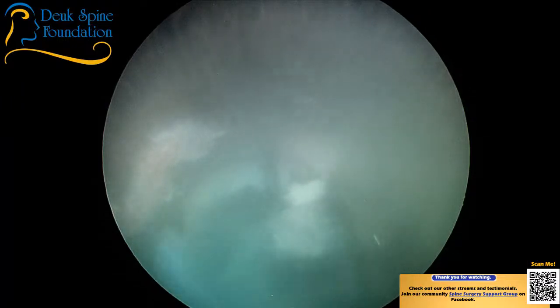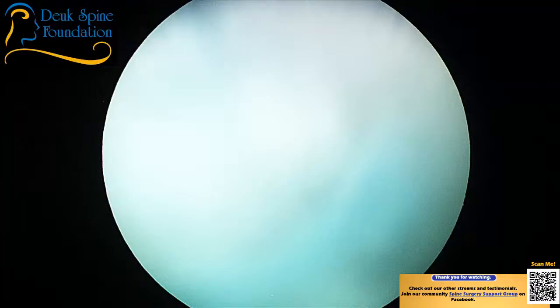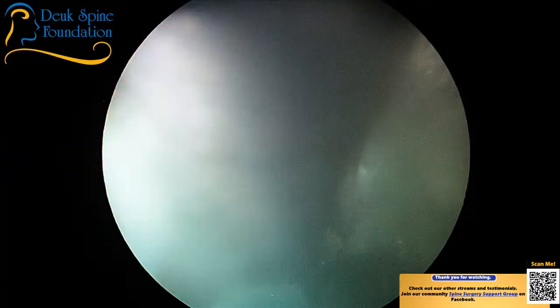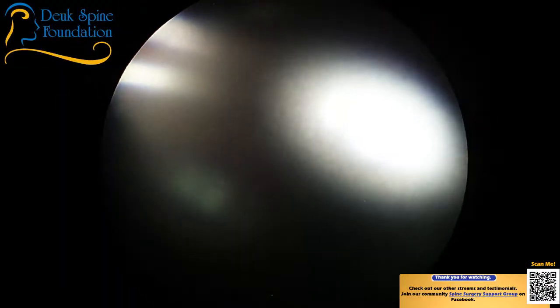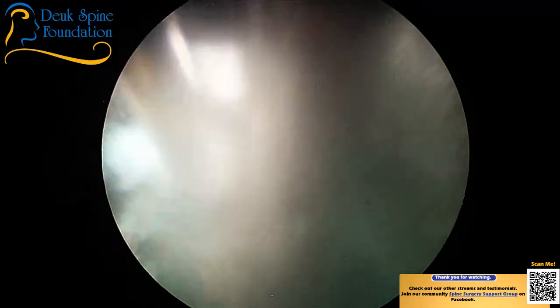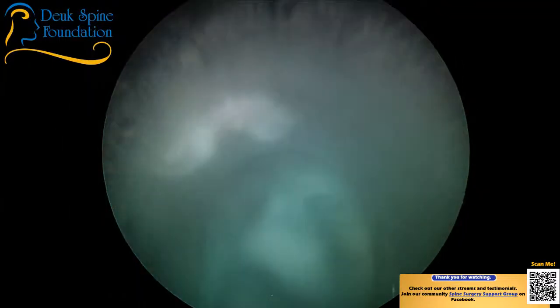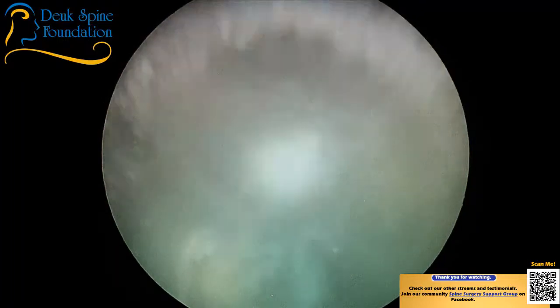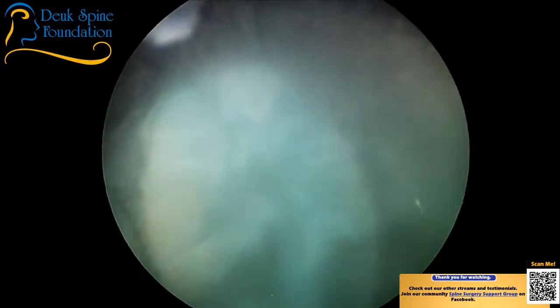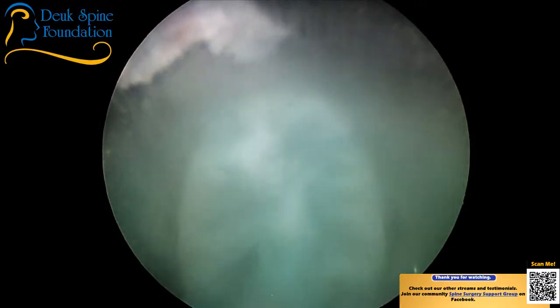So even this lady with collapsed discs, she still has disc material. She still has a disc herniation. And most importantly, she has an annular tear, which is a tear in the annulus fibrosus, which is the band around the nucleus or jelly. It holds the jelly in place inside the disc. And the annulus fibrosus is where this patient's pain is coming from. It's called an annular tear. You're going to see it. It's right here. See that tear right there? There's white, and there's a tear.